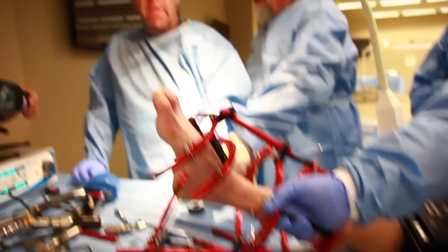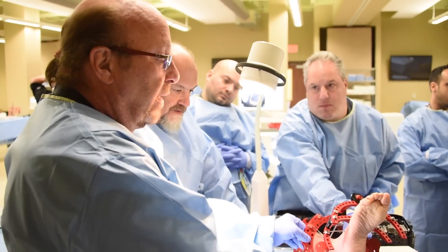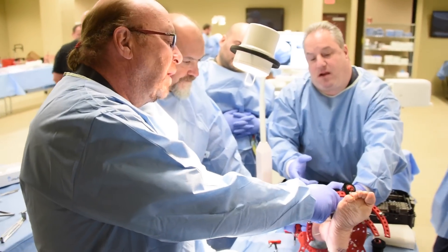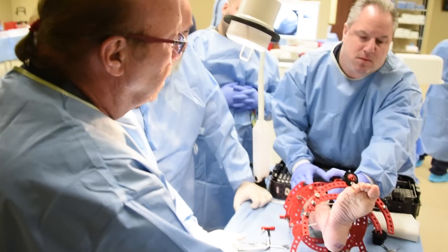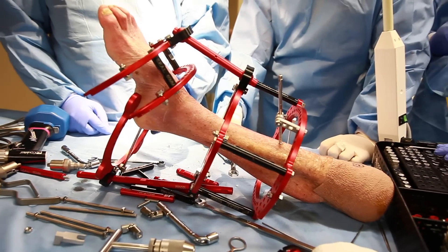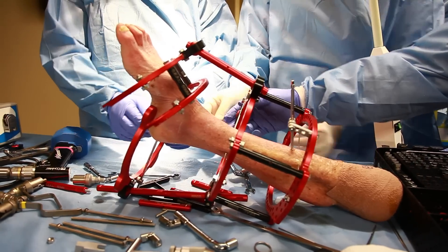If needed, you can throw an olive wire right here to bring in the lateral wall. You do need to connect another strut here, which you can do without any difficulty — because it's not going to be stable without it. You need to connect these two so that you don't get any rotation in that plane, which is easy to do. Put one here and another one here to connect these two, and then it'll be stable in that plane.